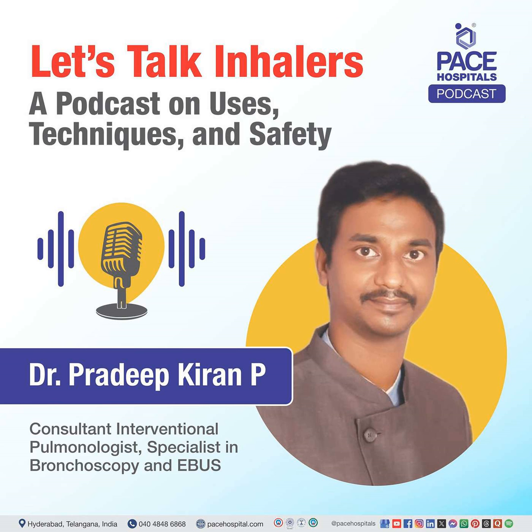Doctor, I have always wondered, can children actually use inhalers? Is it safe for them? And how does it work for kids compared to adults? Yes, any age group can use inhalers, especially children. There will be specialized equipment, like a spacer device, through which you can deliver the inhaler.